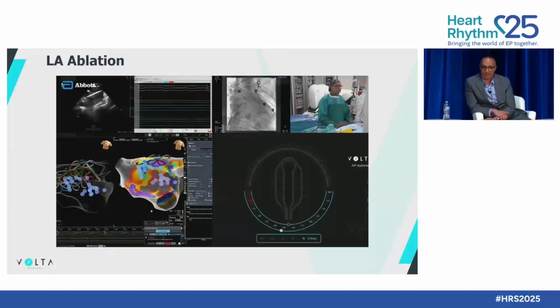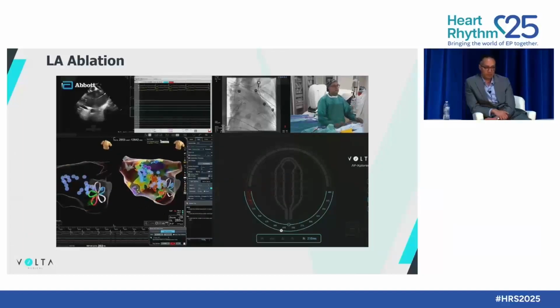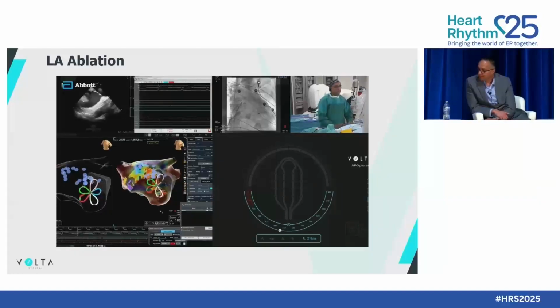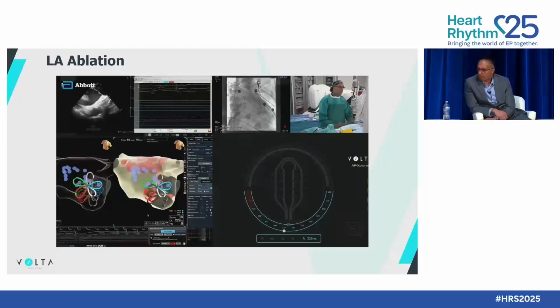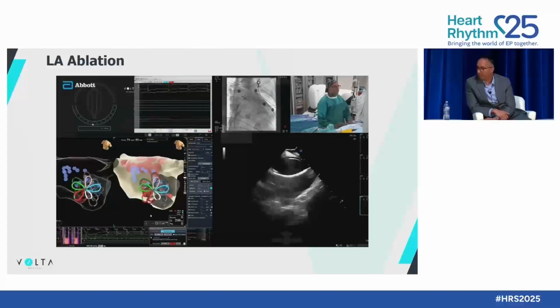And so I think that the marriage of pulse field ablation and Volta is a good one. And that we can now, and no pun intended, tailor our ablation strategy to be able to actually deliver energy appropriately and safely. It is kind of incredible that both Restart, which we were a part of at Penn, and Tailored as well, were RF ablation cases. We did a lot more ablation than we typically will do.